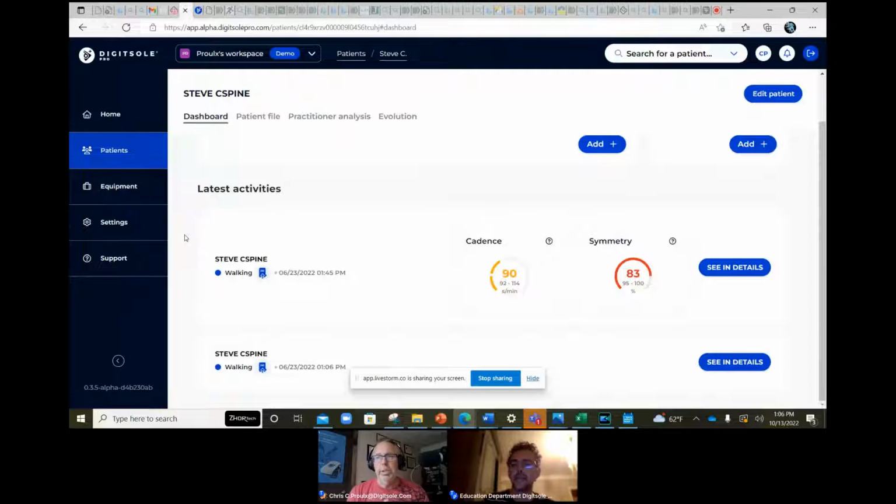So we wanted to see if there was still some opportunity, and the opportunity that we were looking to investigate was the use of shockwave therapy, extracorporeal shockwave therapy, using focused shockwave, although we were also using a radial pressure wave or extracorporeal pulsed activation technology. I won't get into that specifically, but the idea was to evaluate the potential difference in treatment that this may have.